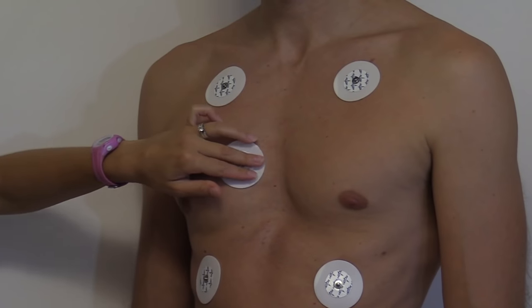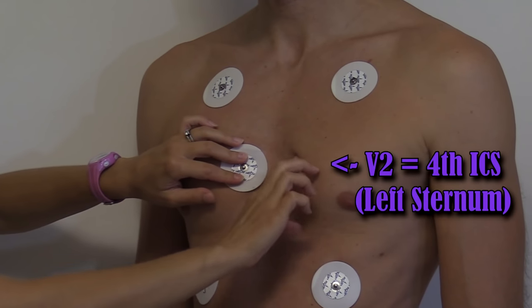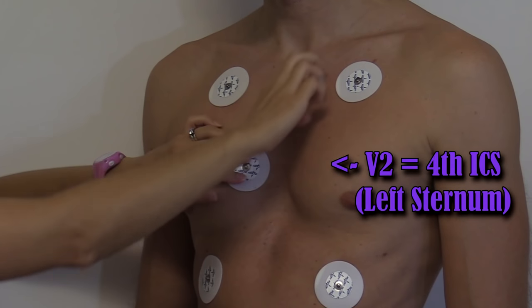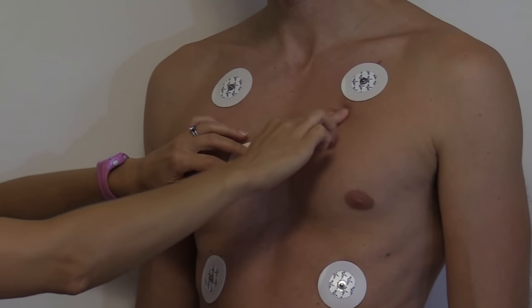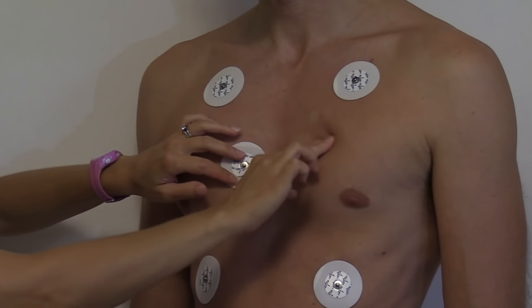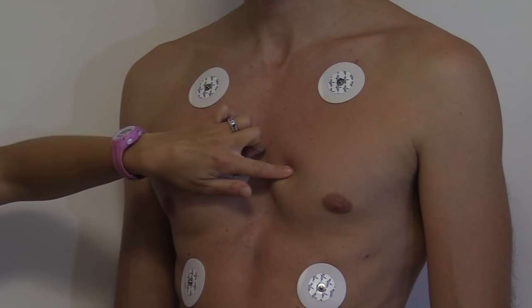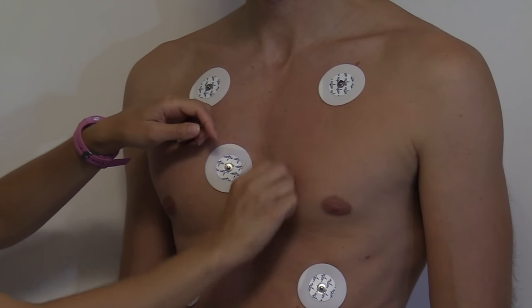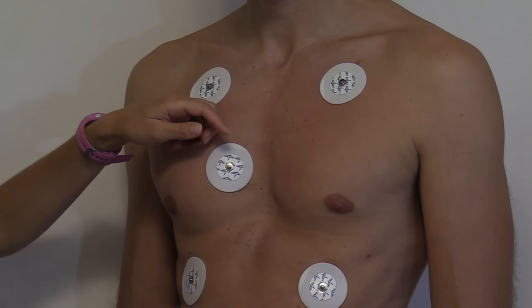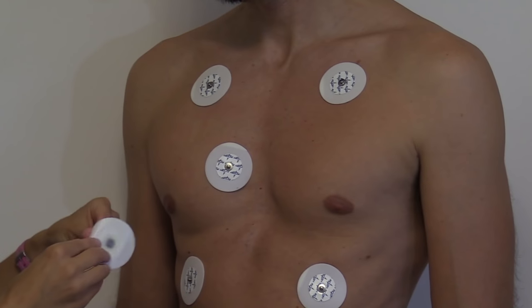V2 is going to be right beside V1 on the opposite side. Again, find your sternal notch, go down where the hump is — your angle of Lewis — find the second intercostal space, third, and then fourth, and it's going to be on the left side. Cleanse the area, rough it up, and then place your electrode.